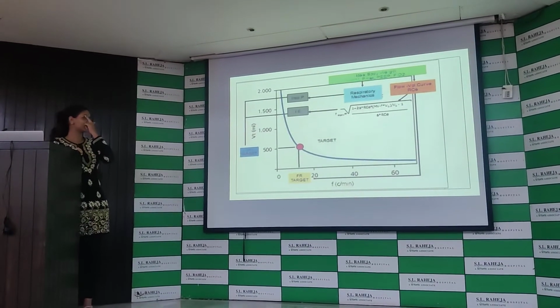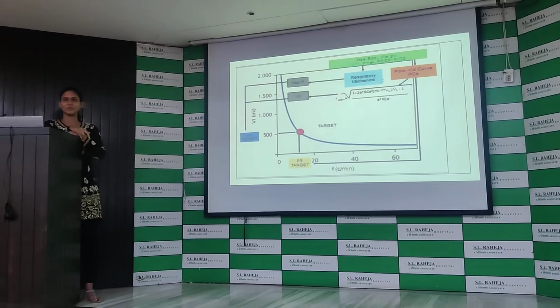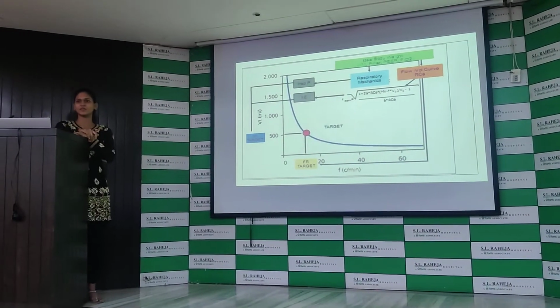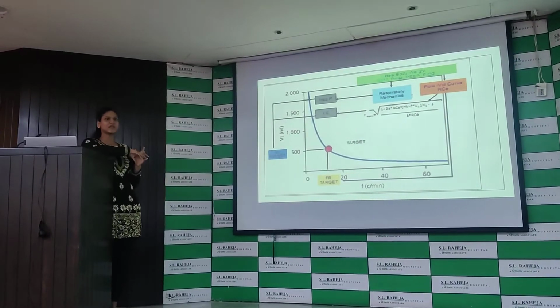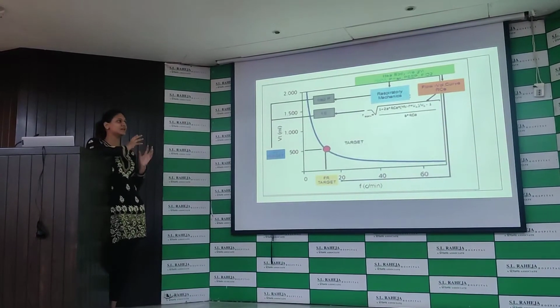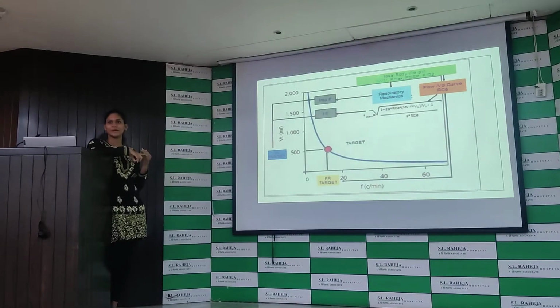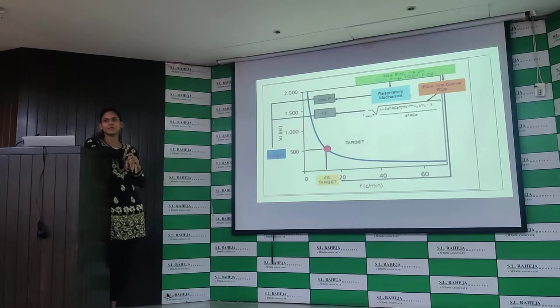So once we put our ideal body weight in our ventilator, there are certain settings which we set in an ASV mode, which is the percentage of the minute ventilation, the PEEP, the FiO2. Through the closed loop mechanism, it judges the respiratory mechanics, as in the compliance and the resistance, and puts them into the Otis equation.